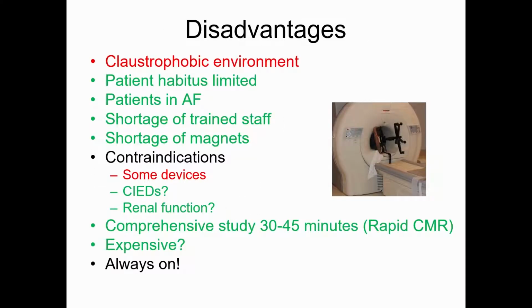What are the disadvantages? Well, I've actually updated this slide and color-coded many of the disadvantages which I've had listed for the last 10 or 15 years. I've moved them to green, really, because we've worked through a lot of this. Obviously, it is a little bit claustrophobic. It's got less so because the scanner bore has got bigger in all of the modern machines now. We're not really limited by patient habitus very much now. I mean, the table will take, I think, 180 kilos. A 70 centimetre bore will take most patients, maybe not some of the really large ones.